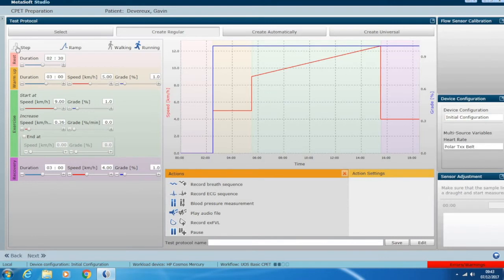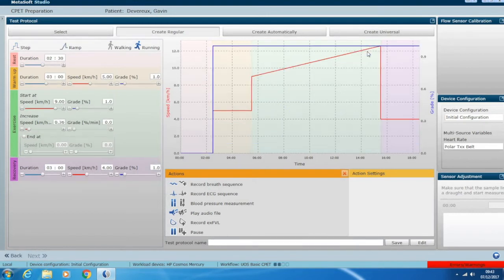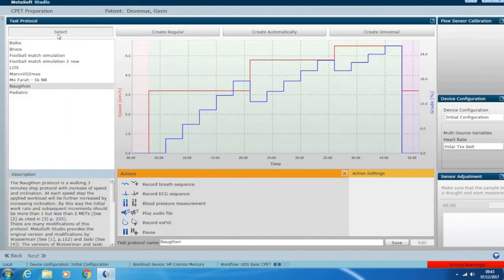So just remember the key differences between maybe an incremental step test that maybe has a step length of 3.5, 4 minutes maybe. What do you get from that? Or what are you able to measure? And then with a smooth ramp protocol, what do you maybe lose, but what does it become very efficient for measuring? Obviously, without giving you the answer and giving the game away, I can't go much further, but we've covered this in previous modules and previous weeks. So it does not matter necessarily what you choose, as long as you have a justification.